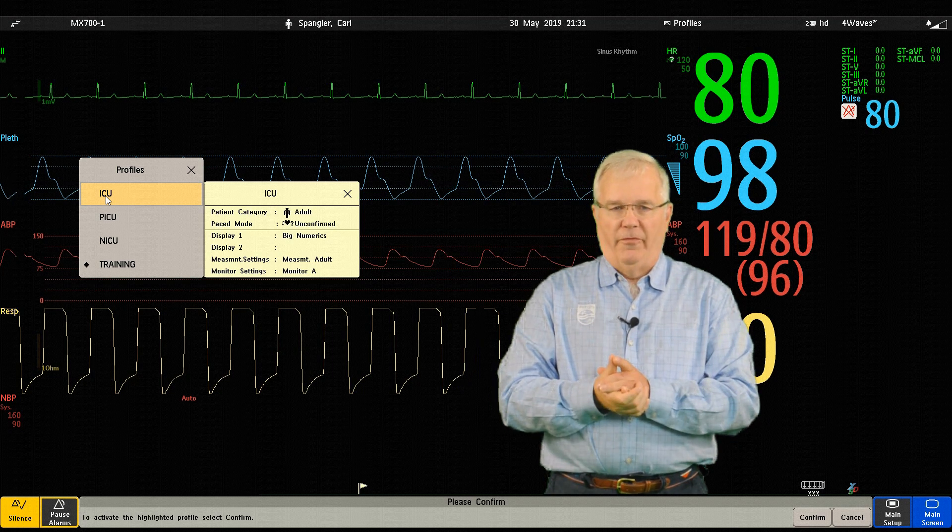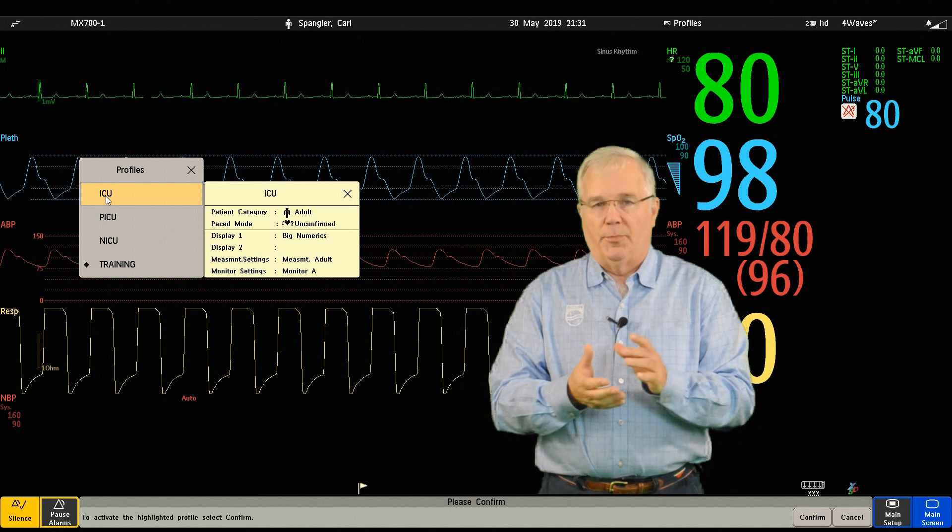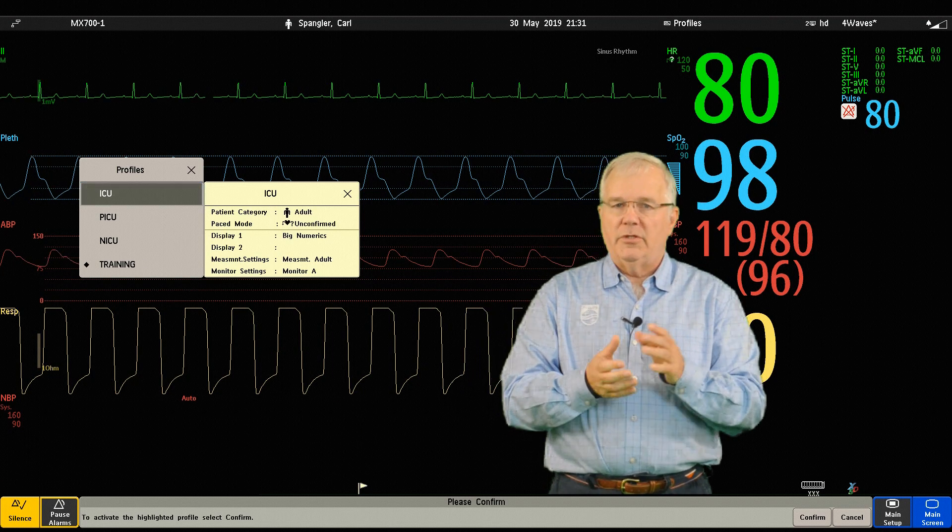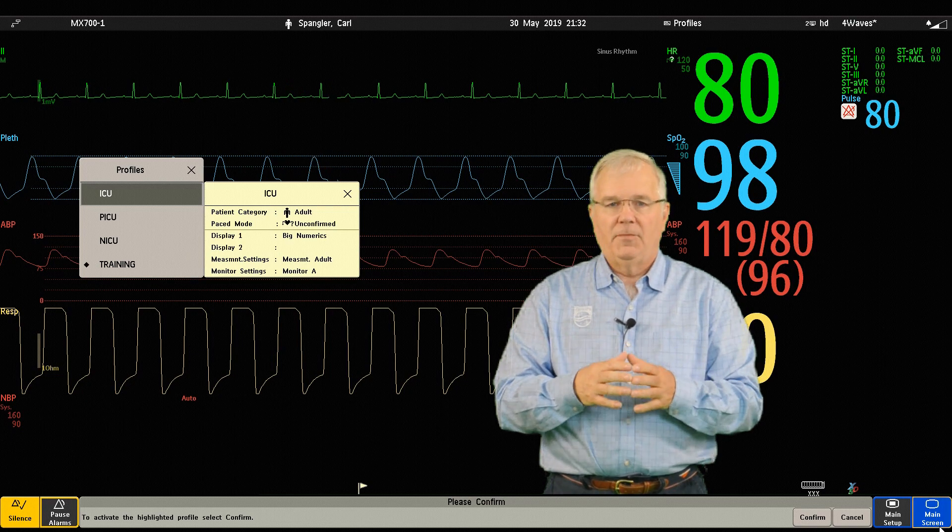So let's change a profile. But before we change the profile, just exactly what is a profile?